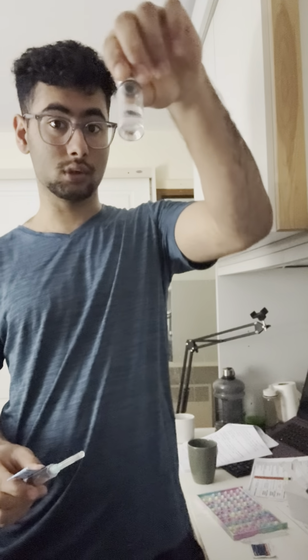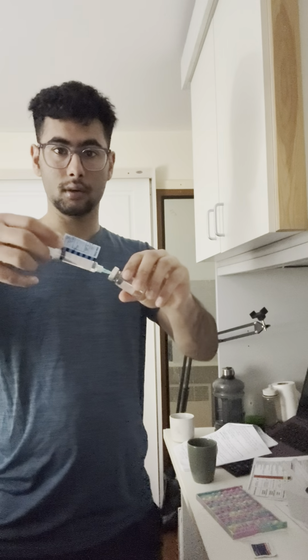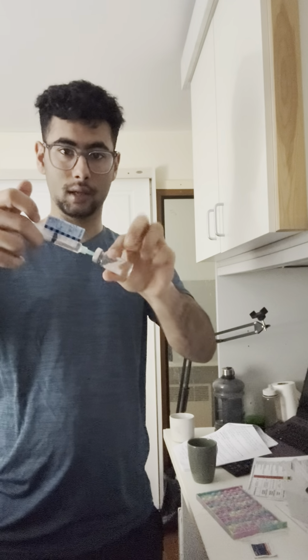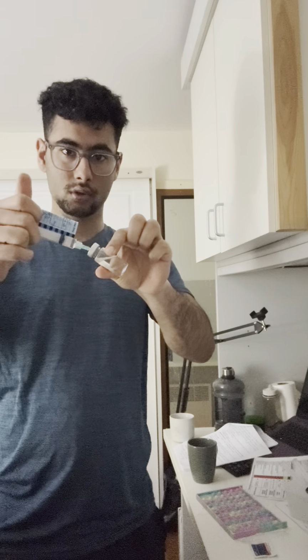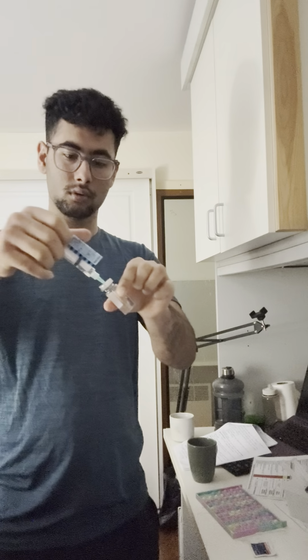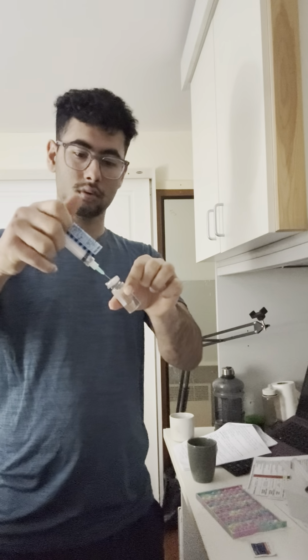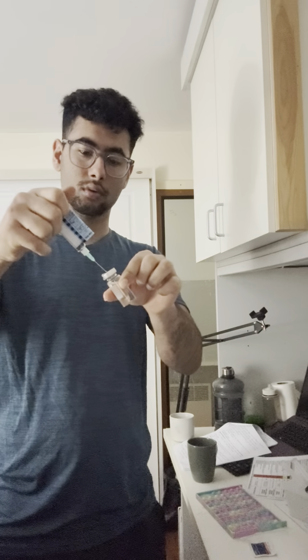Cool. What is this? This is the antibiotics that we're going to use. We're going to mix it up, right? So take this out, and prick here. Now slowly goes in. As you can see, it's going in, right? Slowly going. Now the only thing that you need to do is, cool. Now you're going to mix it up.